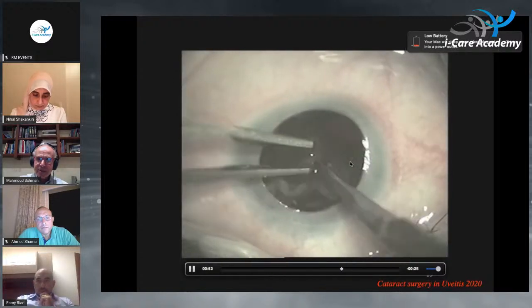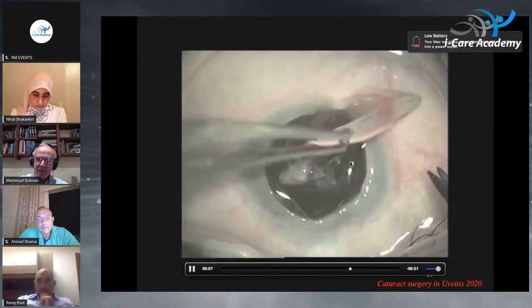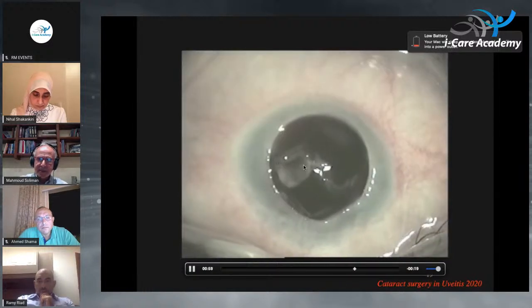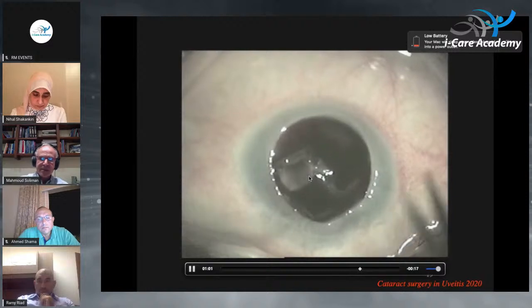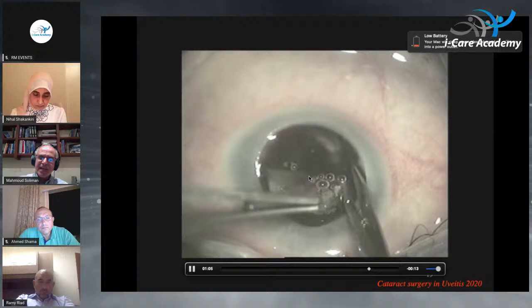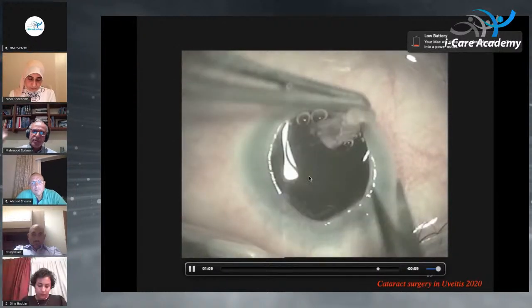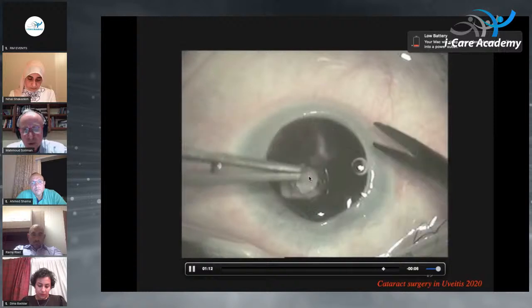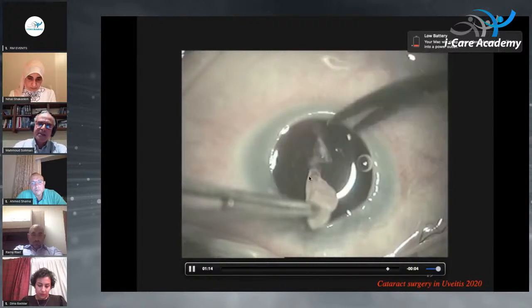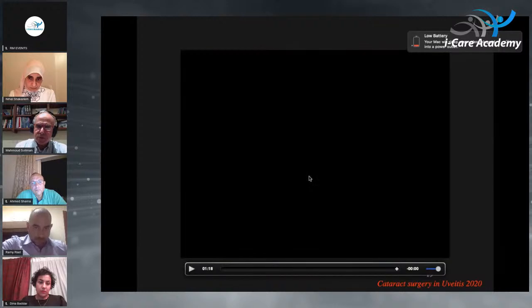Again, after you remove all this tissue, this is the lens here, and this is the capsular bag. So you remove the lens. This is a hydrophilic acrylic. This is the capsular bag. You remove the capsular bag. You do an anterior vitrectomy, and then you place your graft. After cleaning all the anterior segment, you remove the iris. You remove the fibrous tissue completely. You remove totally the iris. This is the only chance for the patient to actually have some vision. This patient.